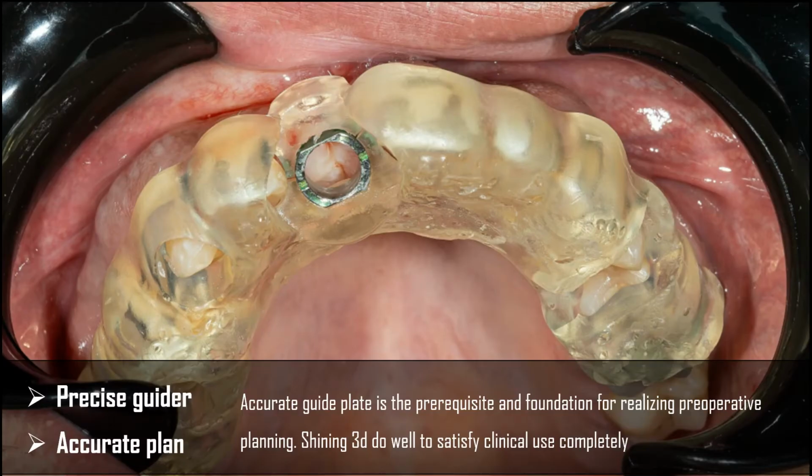Accurate planning and a precise guide plate are very important, which determines the therapeutic effect to some degree. The implant position and depth will affect the fullness and aesthetics of the soft tissue around the implant body, which in turn affects the aesthetics of the restoration.